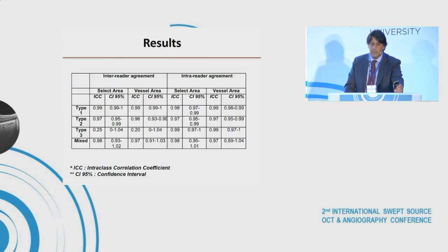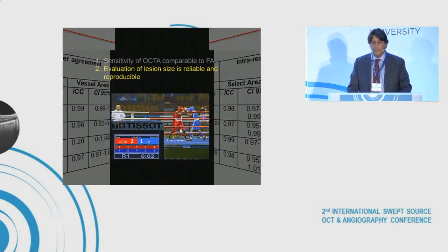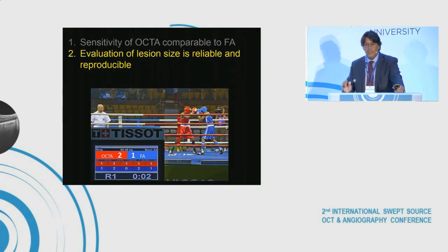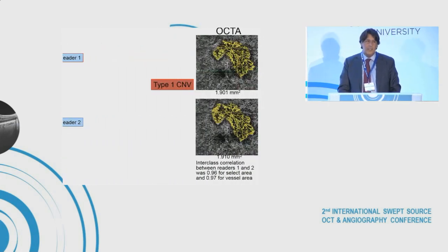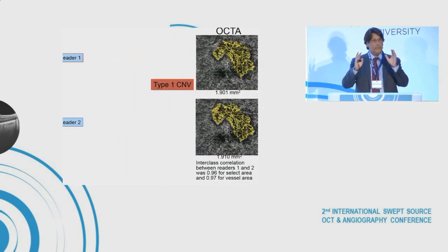So this is the agreement in the study we performed. So yes, we can evaluate the size of the lesion. It is reliable and it is reproducible. That was not so obvious in FA. So one point more for OCTA. We are able to quantify the lesion.